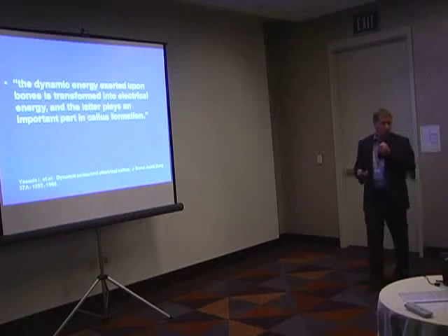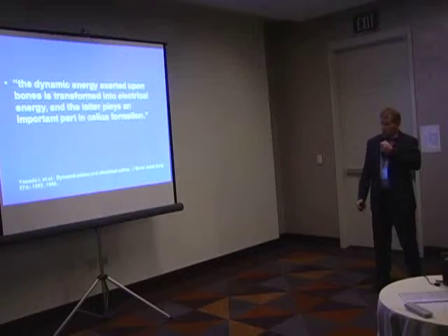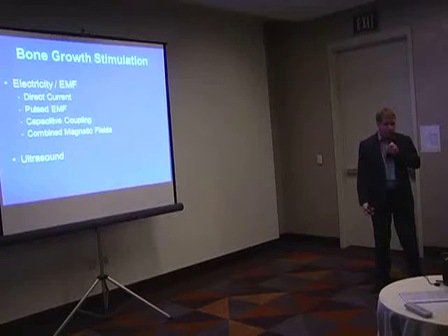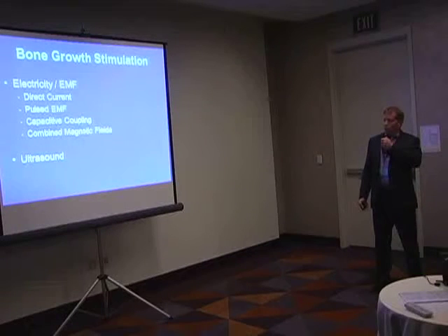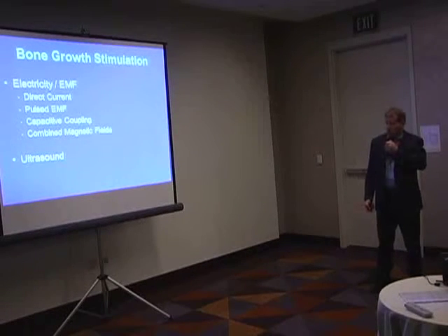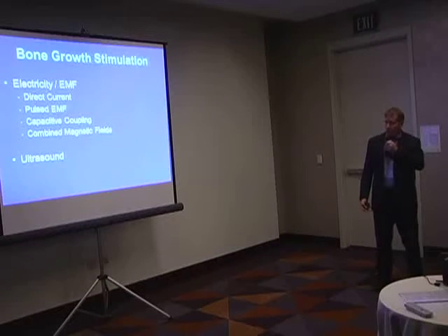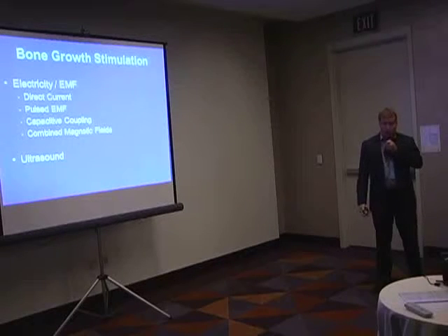This really was the genesis for all the research that's been done, ultimately leading to these sophisticated devices that you see on the table here for trying to improve callus formation. So again, I neglected to put shockwave therapy here too, which is another form of mechanical energy, but for electric bone stimulation, there are direct current implantable devices, and then for non-invasive devices, there are pulsed electromagnetic fields, capacitive coupling, and then these devices that are so-called combined.